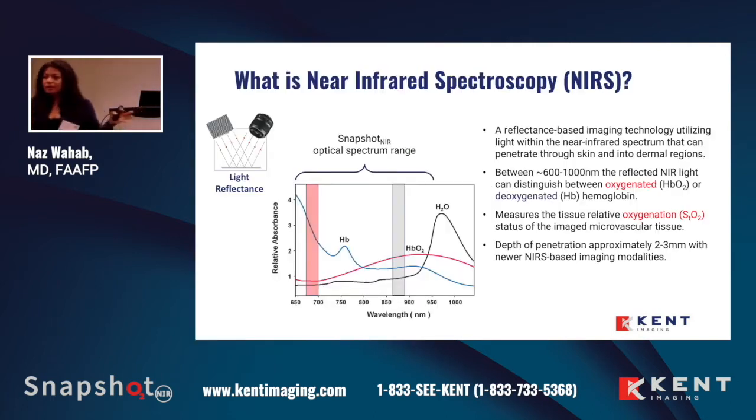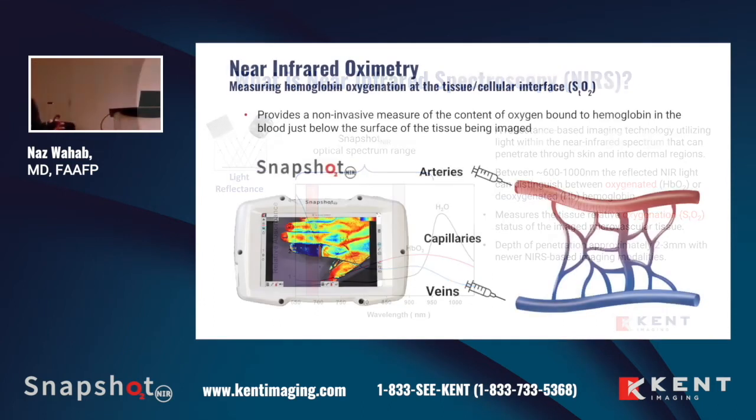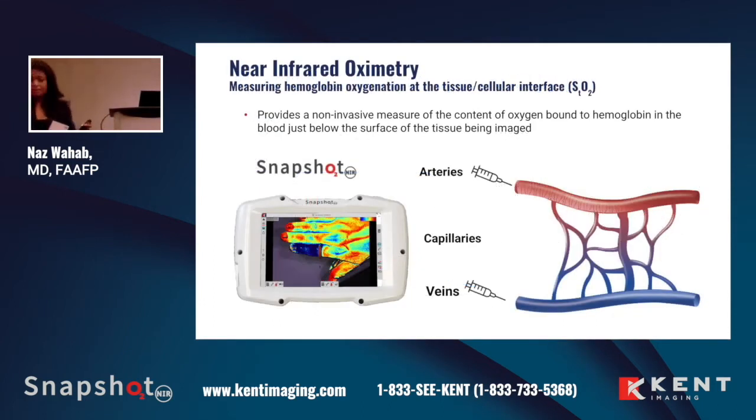So what exactly is near-infrared spectroscopy? What are we doing? Why do we have it? What are we thinking about? Those of us who've been practicing for a number of years have seen the evolution of oxygenation and how we are evaluating that. Going through the basic sciences of this is sometimes a little bit belaboring, so we'll go a little bit more into the case series on how to utilize it, because I do think there's a learning curve for those of us who are clinicians on how to use it.